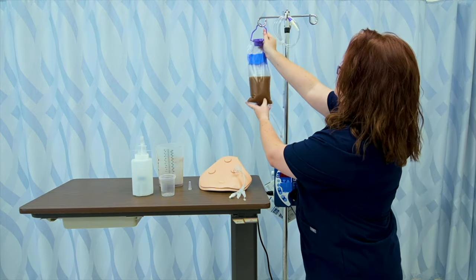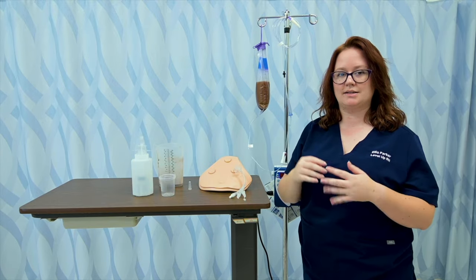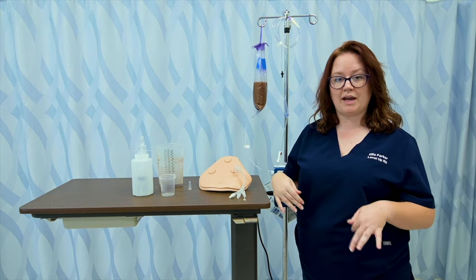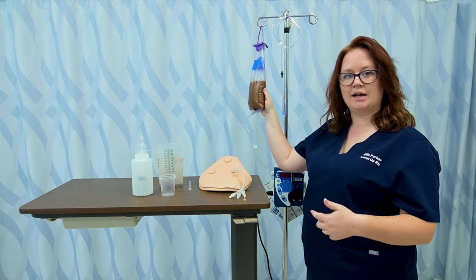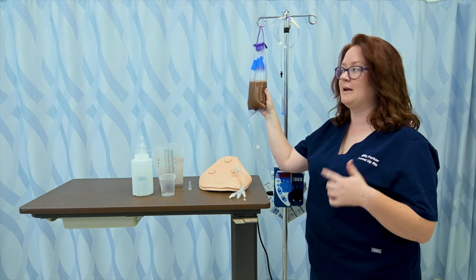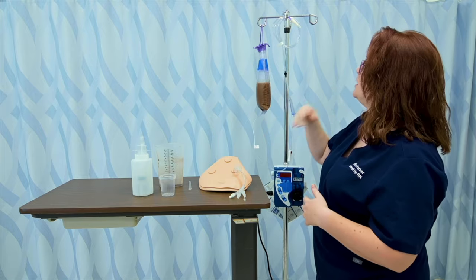I'm going to hang it up. I've already checked to make sure this is the correct product and I'm using the correct method of insertion at the correct rate. All of that information should be labeled on the bag — what this is, when it was hung, who hung it — so that anyone coming into this room after me knows exactly what's going on with this patient and their tube feeding.